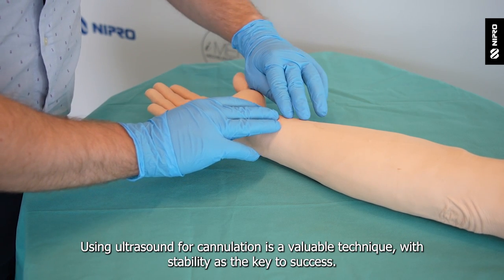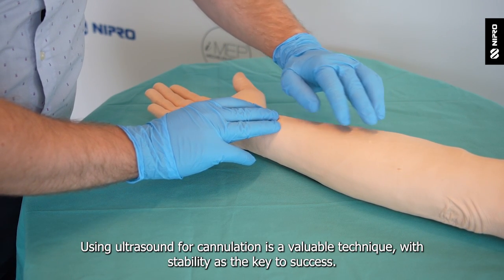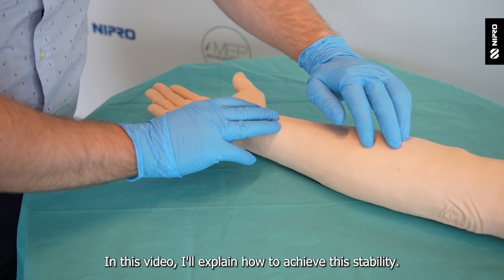Using ultrasound for cannulation is a valuable technique with stability as a key to success. In this video I'll explain how to achieve this stability.